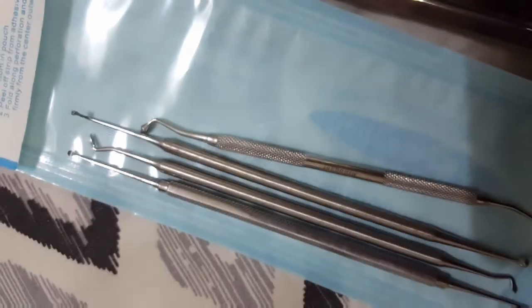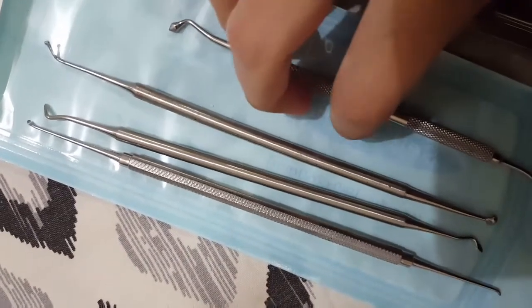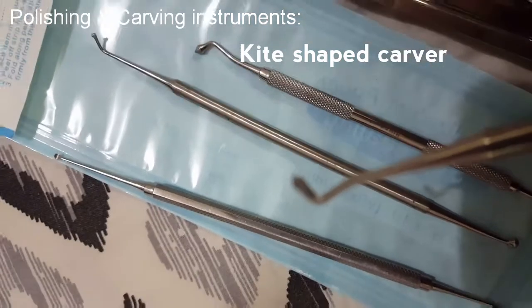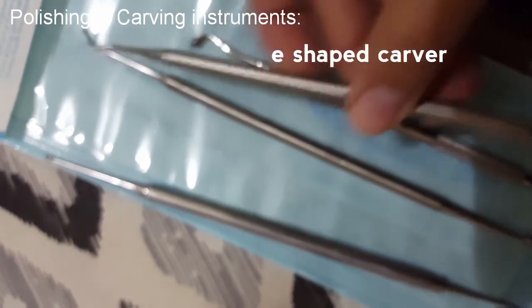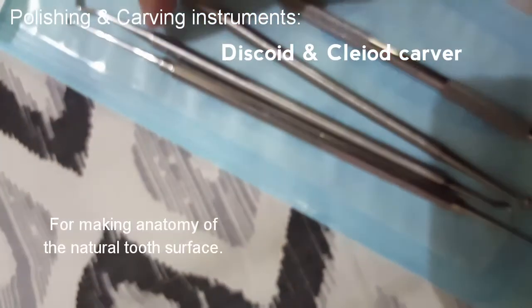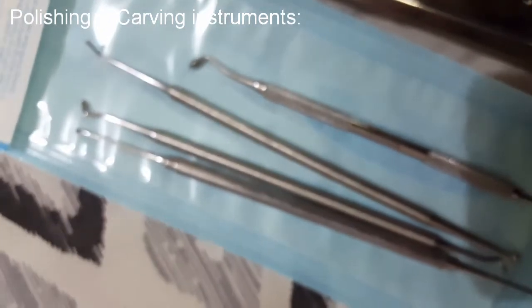Now we have our polishing instruments and our carving instruments. The carving instruments are, as you can see, this one is a kite-shaped carver. You can see it has a kite shape. And this is a discoid and cleoid carver. The carvers are for making the anatomical features on the composite after you have done all the layers, or carving out those features.